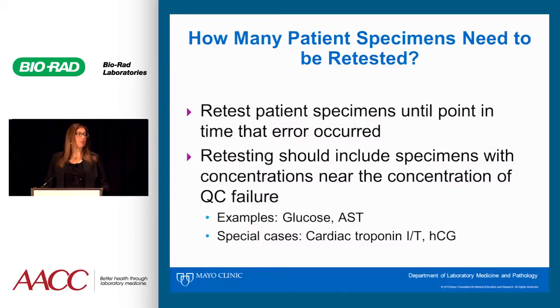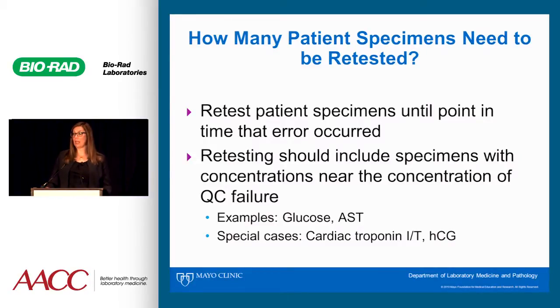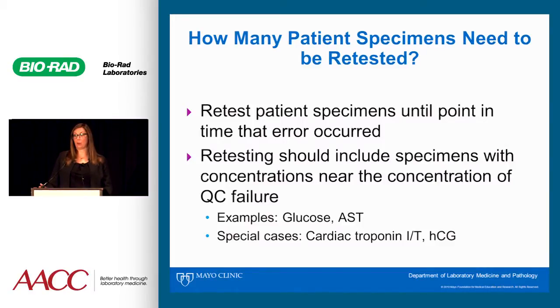Other examples include cardiac troponin T, where perhaps the last 10 samples were all undetectable. I want to go back in time to the point where I had measurable cardiac troponin T concentrations, so that we aren't assuming we discovered the error only because we had a group of patients who did not have an MI.